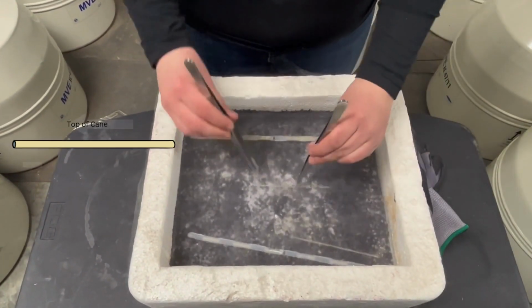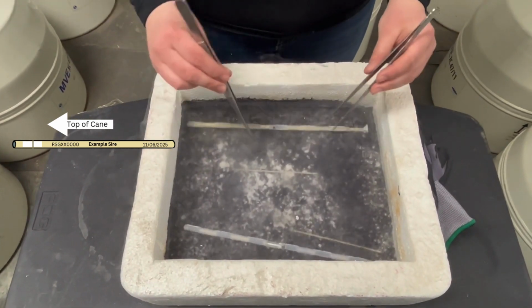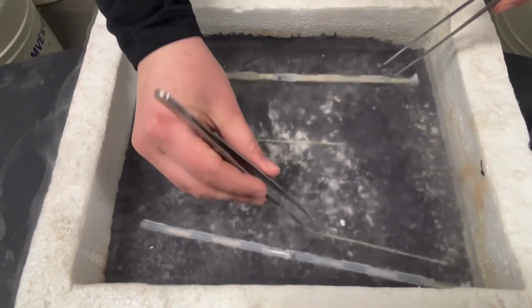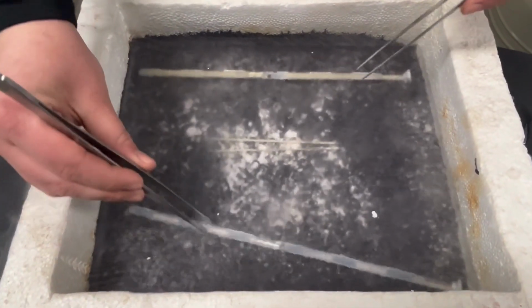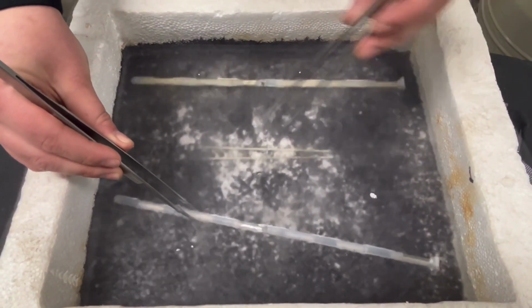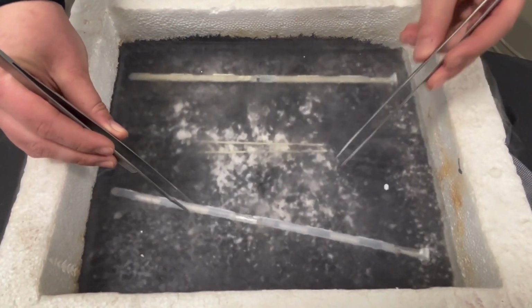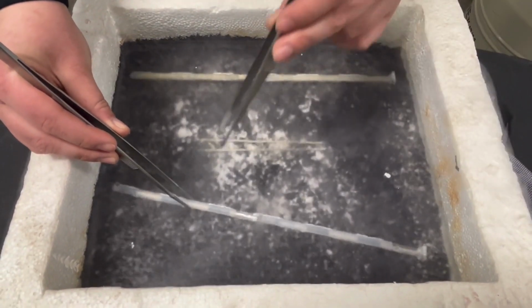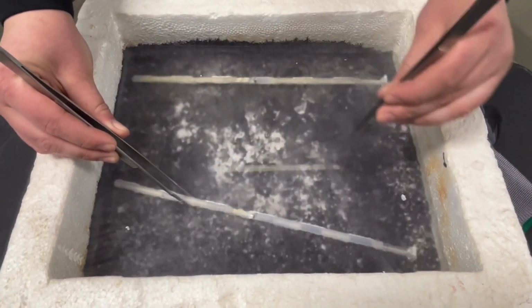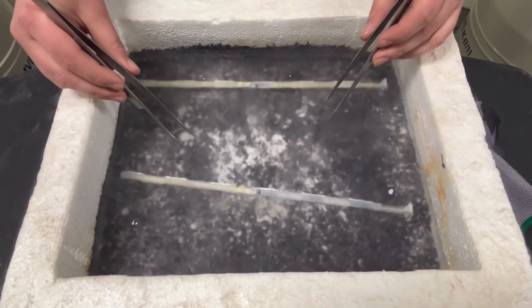And you'll notice that the straws are at an orientation with a cotton plug up. This makes it so that the writing is facing the right way for us to read it. It's just a lot easier to see what's actually printed on your straws. So then all we're going to do is we're going to transfer these 2 straws into the bottom goblet of our receiving cane. We want to fill the bottom first because we have this top goblet on here. If the tank were to tip over or anything, this top goblet up here would protect these straws from falling out. I'm going to pick them up, slide 1, slide 2, noticing that the straws and the canes are still submerged under the liquid nitrogen.